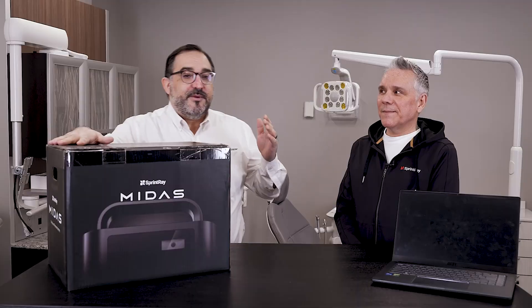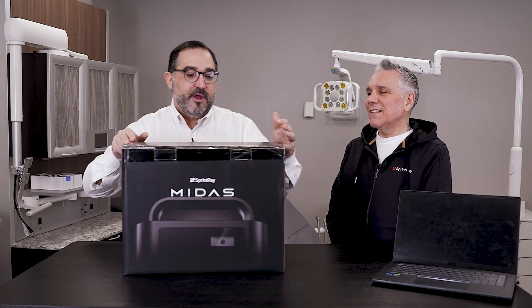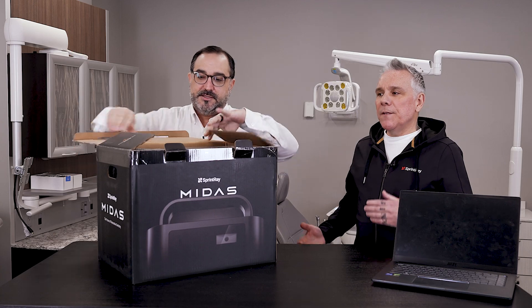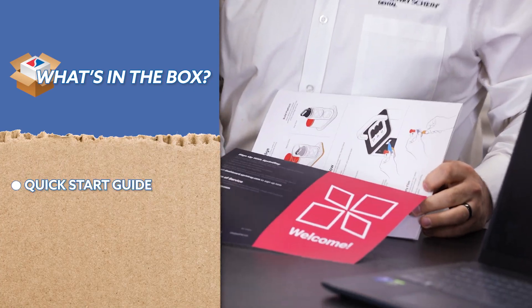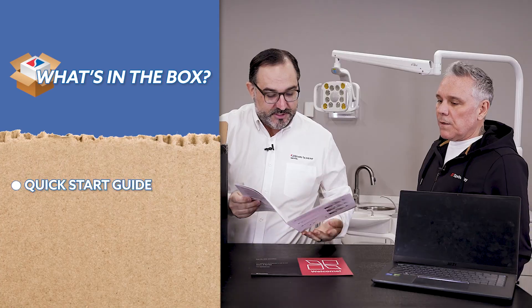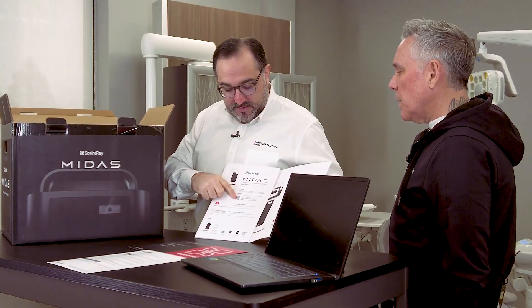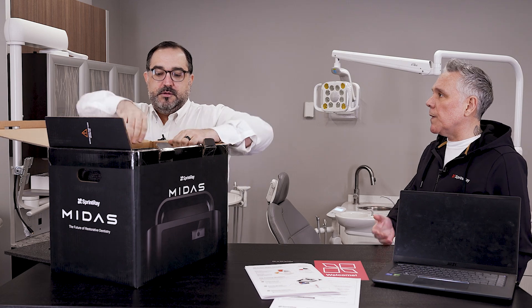I'm lucky enough to be joined today by my friend Toby from Sprint Ray. Thanks for coming down — let's crack this bad boy open. Why don't you tell me what I'm gonna find in this Christmas present of a box? So as you open the box, right at the top we have all of the documentation — a welcome packet, instructions — and there's a QR code here so we can go right into the opening documentation. It can bring simple files or take you to our software suite.